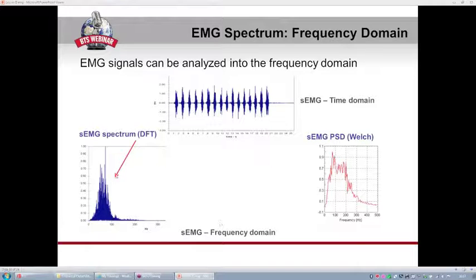The FFT is computed on the global time, and this is the result of the spectrum, while the power density spectrum considers the spectrum on a time epoch and then averages the values. In this way, we can convert the sample function from its original time domain to the frequency domain.